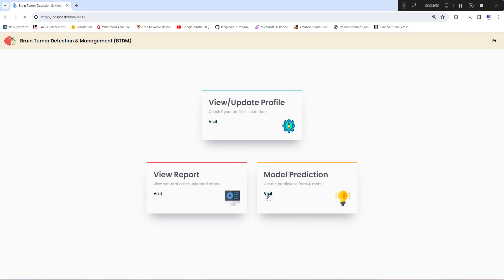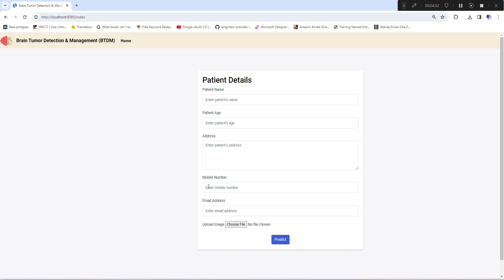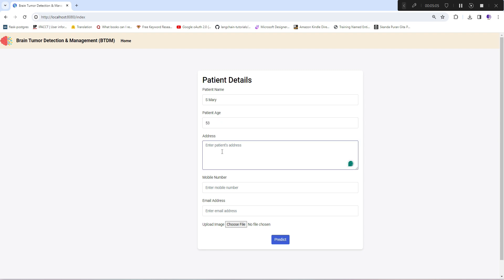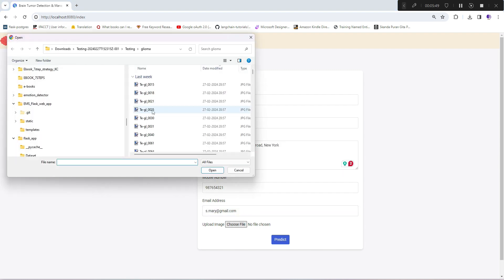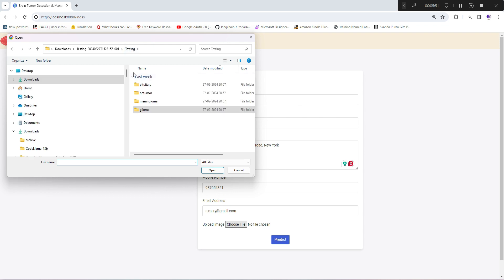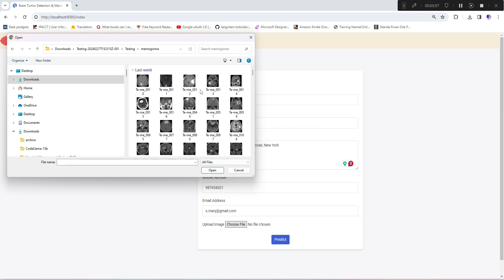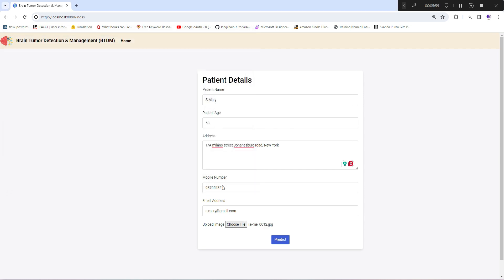I'll quickly visit model prediction where she can enter patient details. I have a folder of all the cases, I can upload anyone. I'll try this one - meningioma - and hit predict.